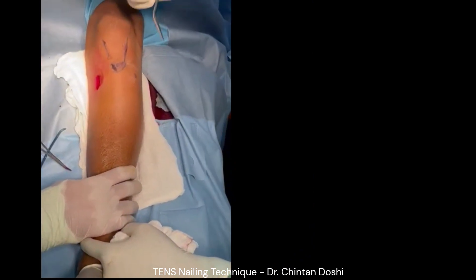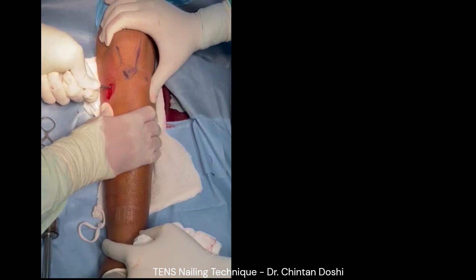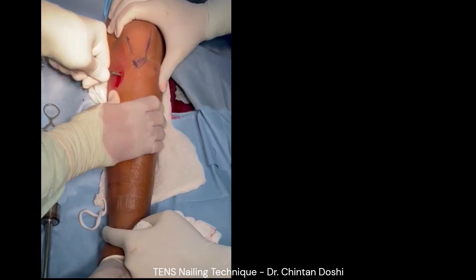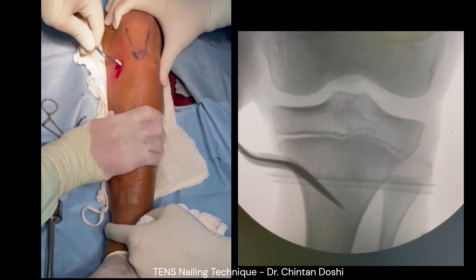An AWL is used to make entry into the cortex with twisting movements to enter the medullary canal. Once the canal is entered, the AWL is tilted to 45 degrees to make a good path for the TENS nail to enter.